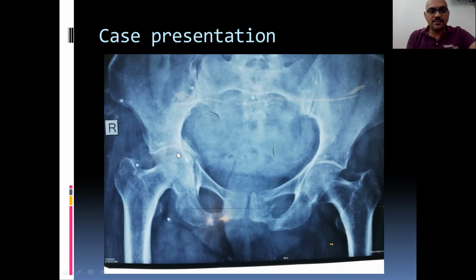She has become immobile, while before the fracture she was free, independent, and in very good health. Apart from hypertension, she has anterior hip pain, and she cannot move her leg. So if anyone can participate to describe the X-ray, please raise your hands.